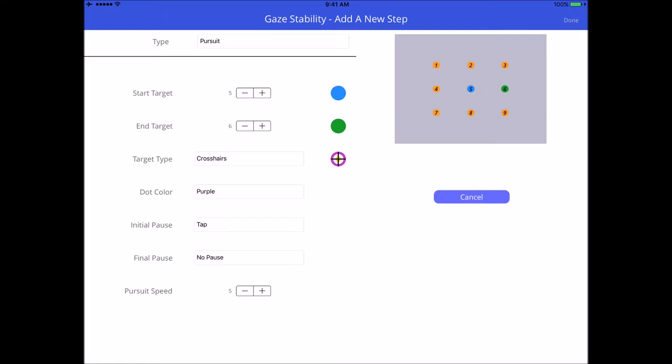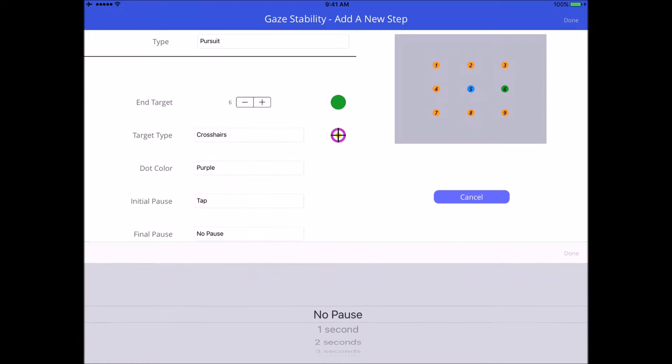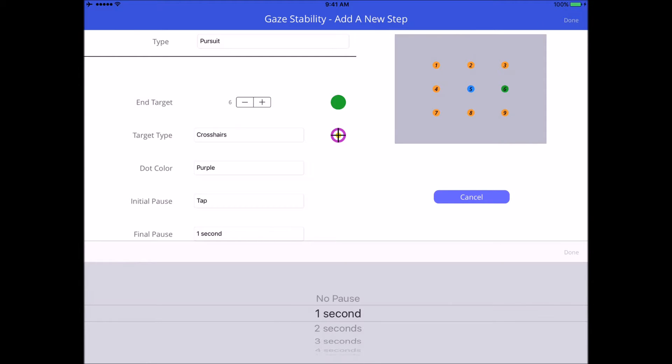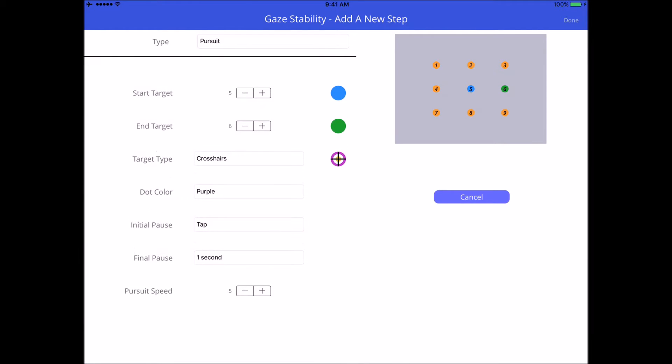By the way, this exercise just is not formatted very well for iPhones or iPods. It works really well on the iPads but it doesn't work on the phones. Final pause, what I'm going to do here is I'm just going to give it one second, because I know that at the beginning of the next exercise which will start from my target six, I'm going to select tap. So the final timing really doesn't matter, I could put no pause if I wanted to because the beginning of the next movement will require a tap.